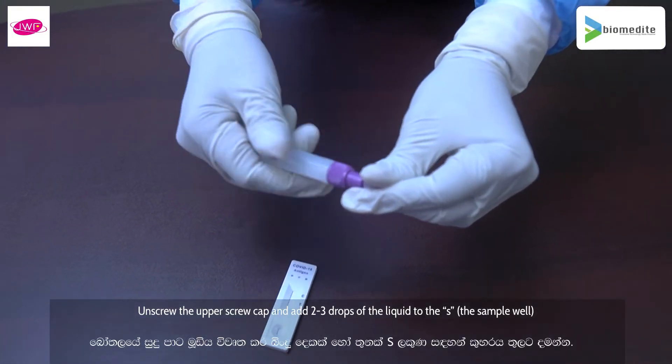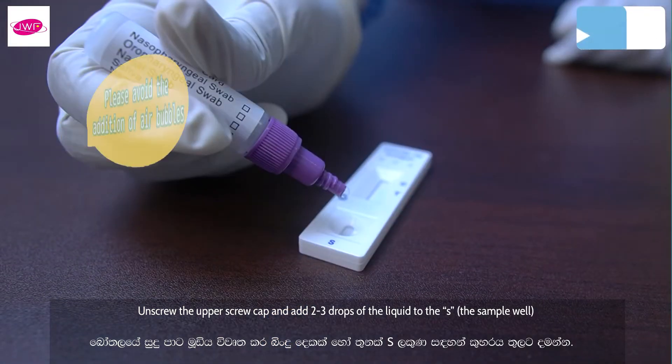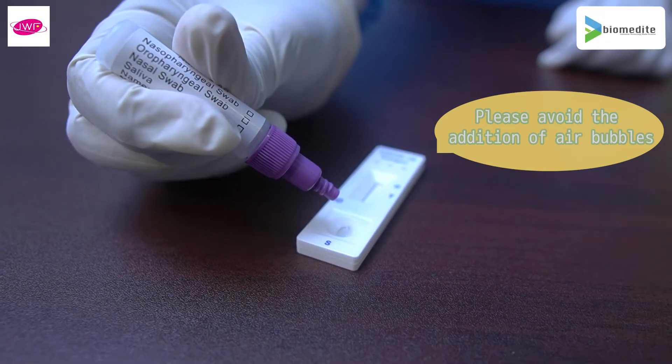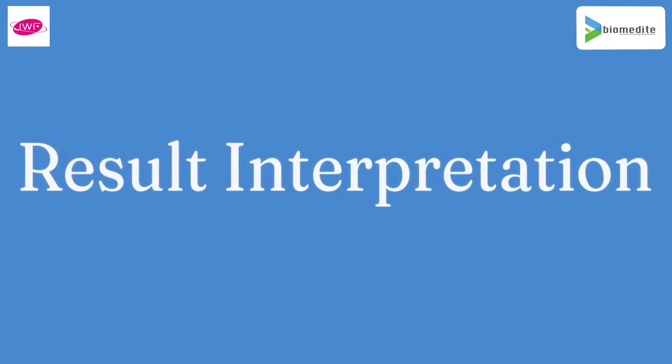Unscrew the upper screw cap and add 2 to 3 drops of the liquid to the S (sample) well. Wait for 15 to 30 minutes and read the results. Do not read results after 30 minutes.